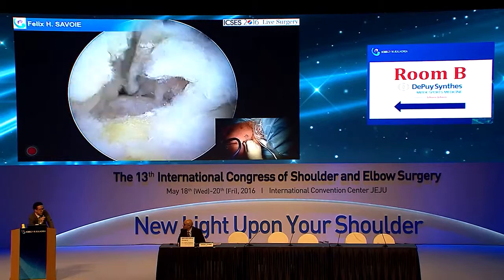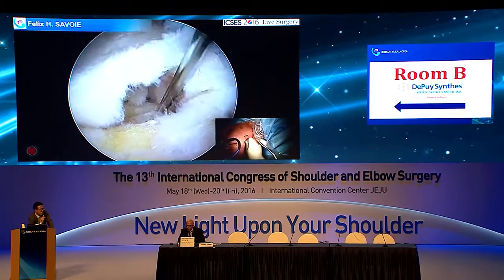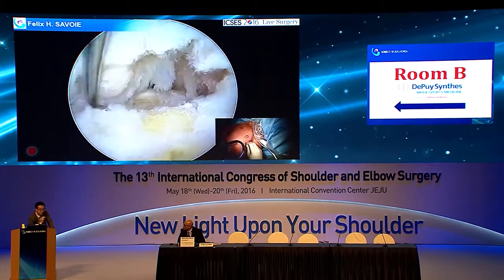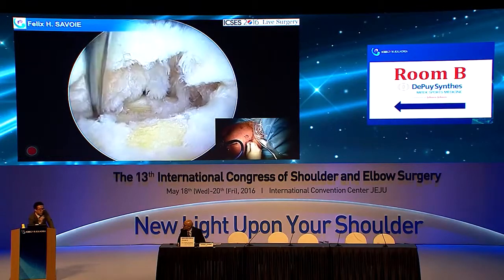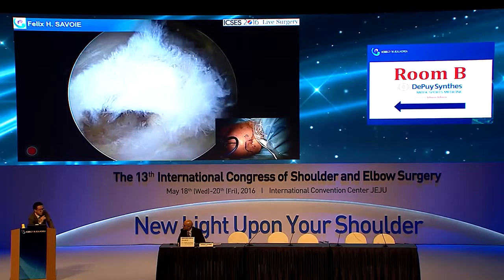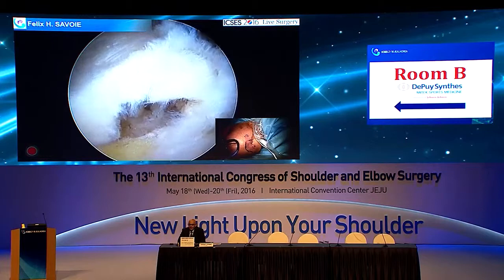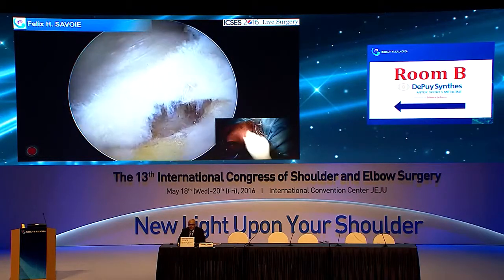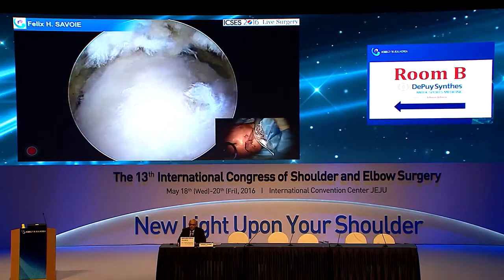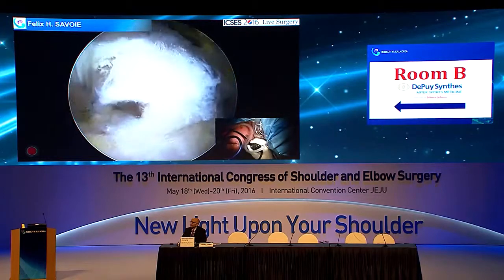Yes. Yep. I encounter those aberrant pec minor tendons quite often, more often than you describe. I published this in the JSES, but I think 1 out of 10 people I find this pec minor. It's just that we don't look for it. No kidding. Yes. So what are your thoughts on that? So I look for it because I release the coracohumeral on everyone. And so I think it may be in the U.S. a little less frequent than that. So do you usually take it, or do you usually leave it alone?